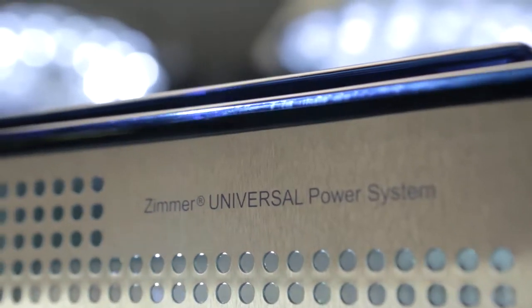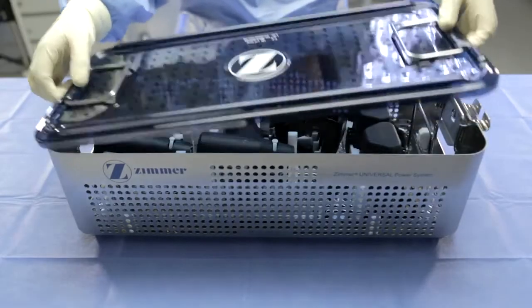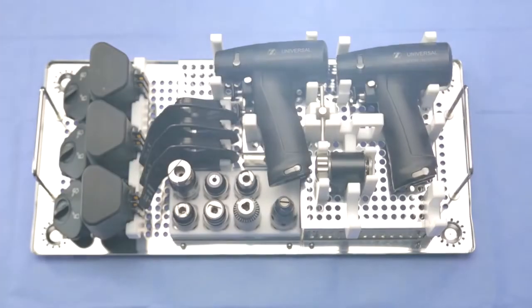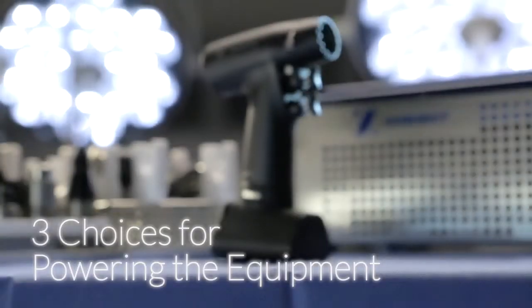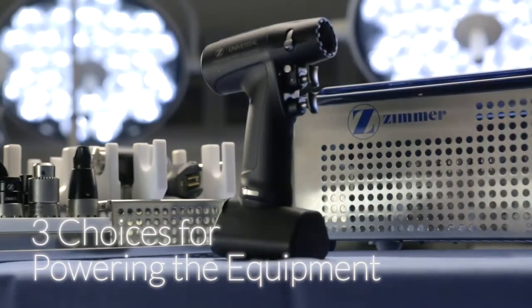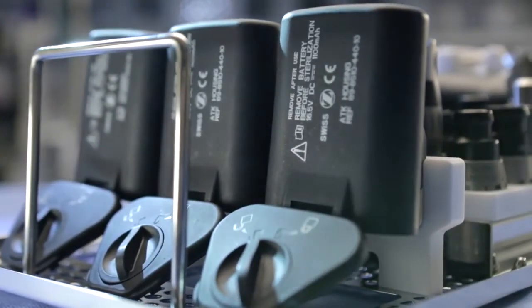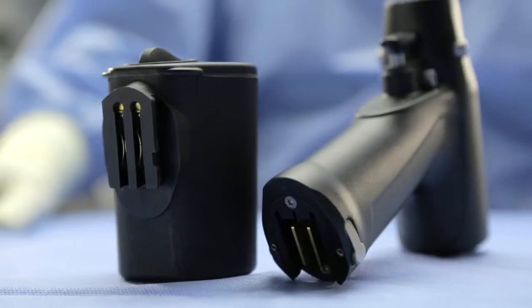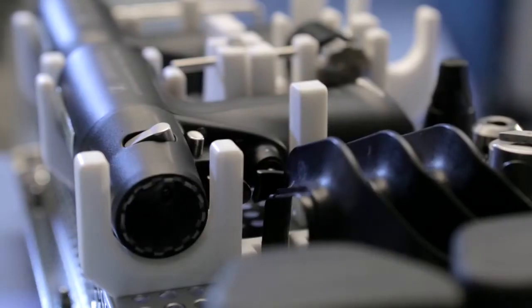Hello and welcome to a video tutorial on the Zimmer Universal Power System. This product is a system utilized for resection in large bone procedures and some trauma procedures. The Universal Power System offers three choices for powering the equipment. In most cases, the use of sterilizable or aseptic batteries are the user's choice. However, the Universal Power System can also be utilized with an electric console or with pneumatic air.